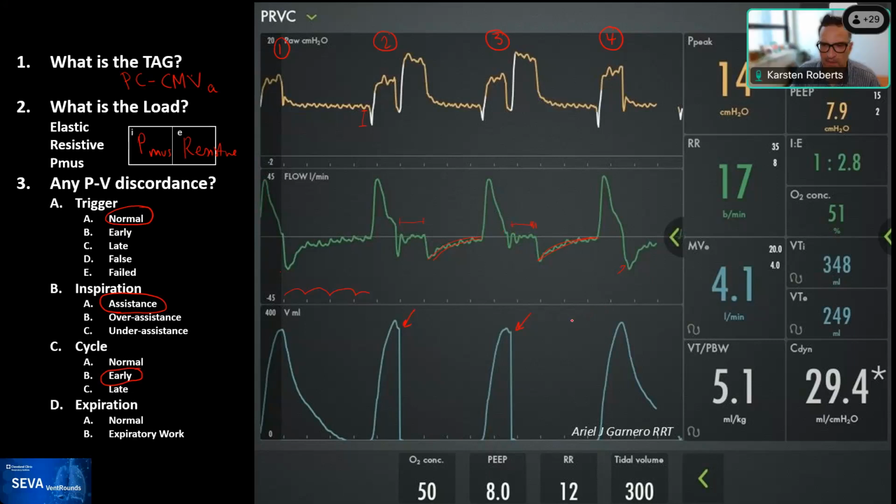Yeah, ACCM says that it's the patient inspiring against the ventilator exhalation. And Ryan asked the question, is the ventilator cycling off because the Pvent has exceeded the safety parameters set in PRVC? It's a good question. A patient is trying to inspire, and for the patient to produce a hold, the Pvent must equal Pmus. I think that's a great comment, Ari.